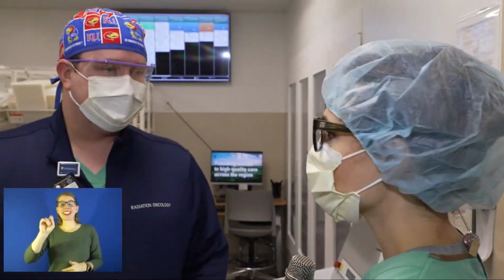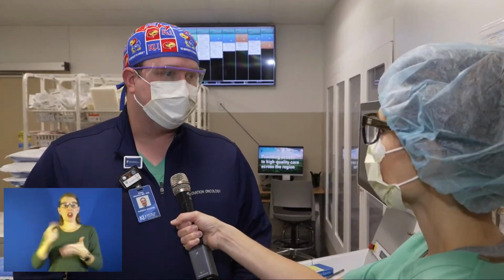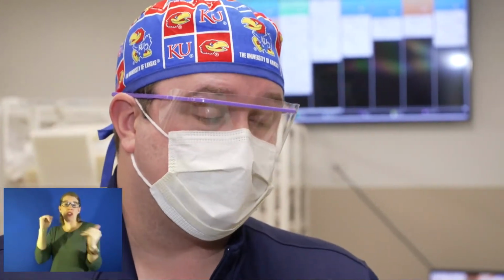You just said this is only going to be another 20 minutes? Yeah, her treatment will be about 25 minutes today. How typical is that compared to treatments in years past? So the most common treatment for women with early stage breast cancer who undergo a lumpectomy is daily radiation treatments over 3 to 4 weeks. This patient's treatment will be 25 minutes, and she will hopefully be done with radiation therapy before she even wakes up from anesthesia.